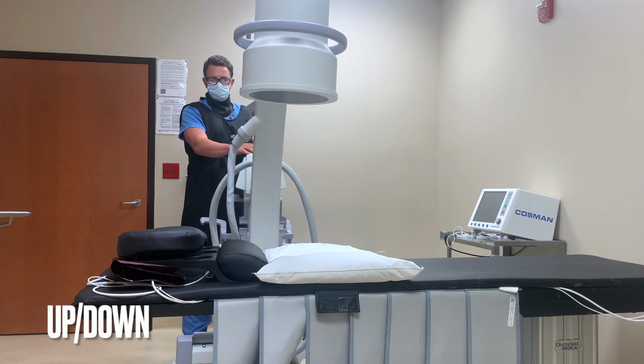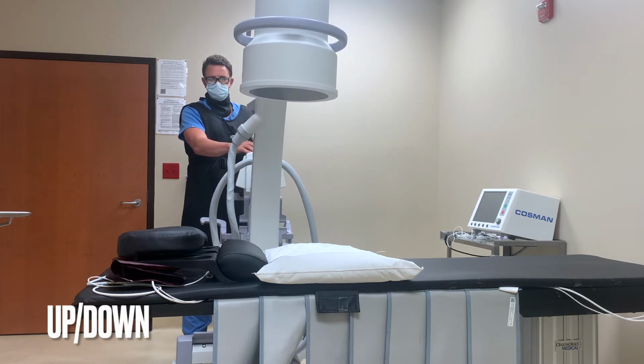Next, we will move the C-arm up or down, which is when the C-arm moves towards the ceiling or the floor.